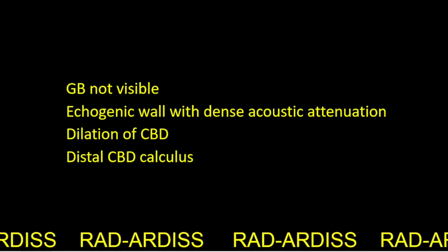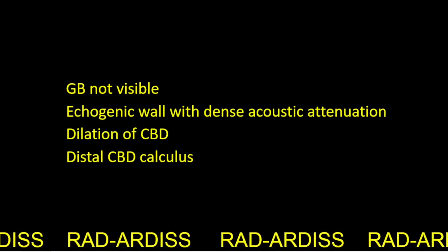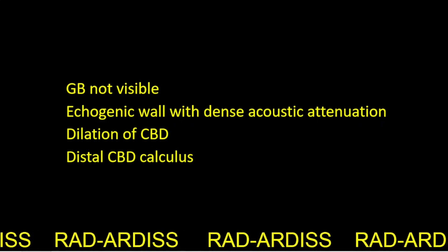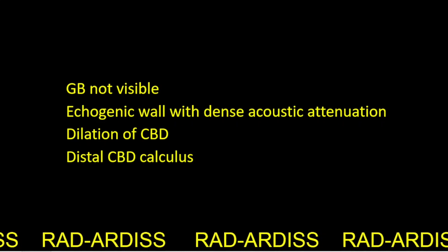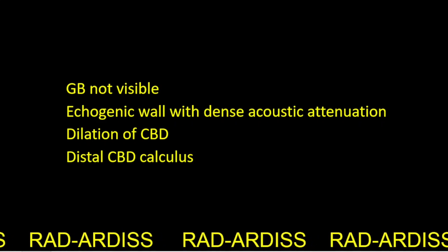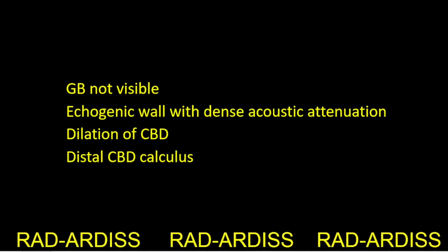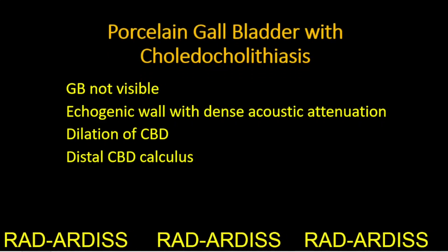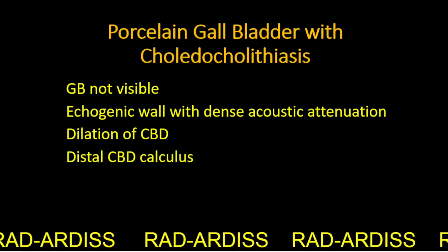To summarize: the gallbladder is not visible; there is an echogenic wall of the gallbladder with dense acoustic attenuation distally. The common bile duct is dilated, and there is a calculus distally inside the common bile duct. This case is therefore a case of porcelain gallbladder with choledocholithiasis.